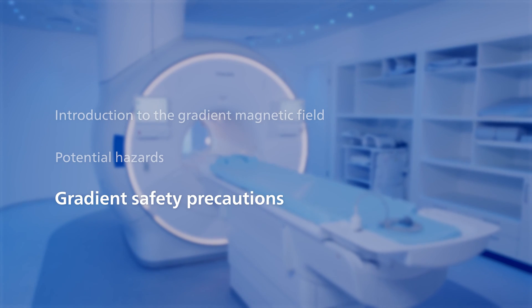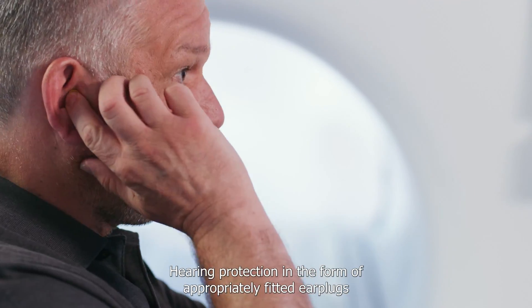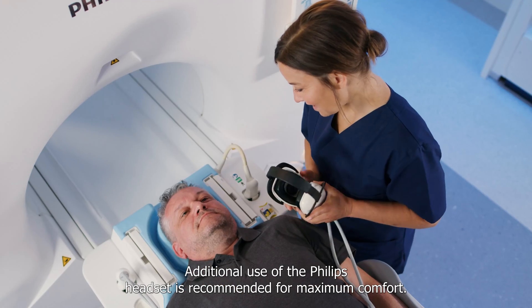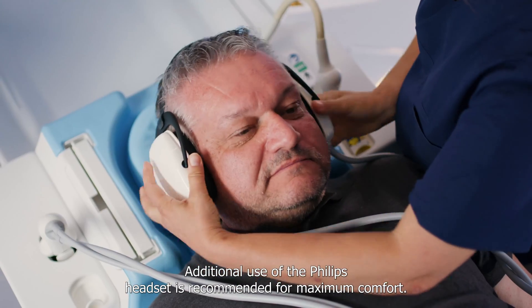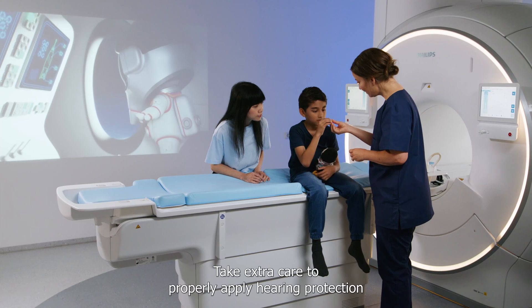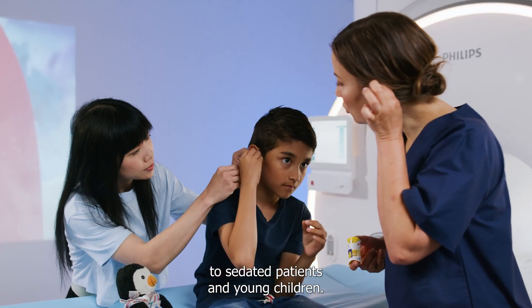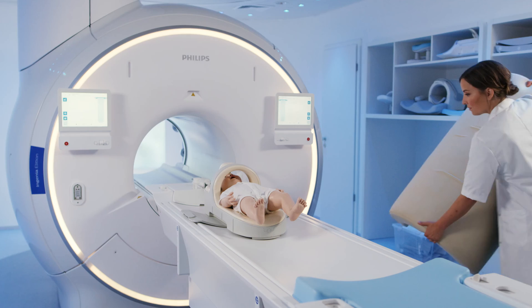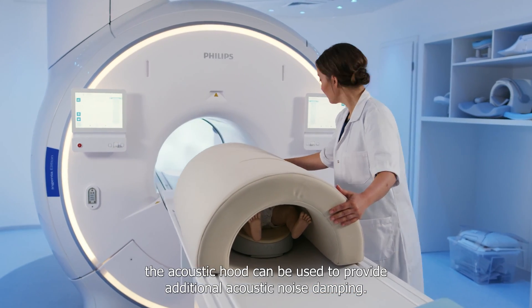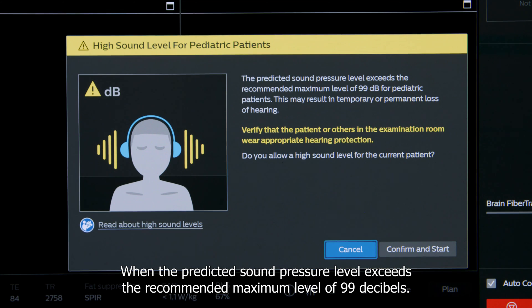Gradient safety precautions. Hearing protection in the form of appropriately fitted earplugs with sufficient damping greater than 30 decibels is required. Additional use of the Philips headset is recommended for maximum comfort. Take extra care to properly apply hearing protection to sedated patients and young children. For pediatric patients, the acoustic hood can be used to provide additional acoustic noise damping when the predicted sound pressure level exceeds the recommended maximum level of 99 decibels.